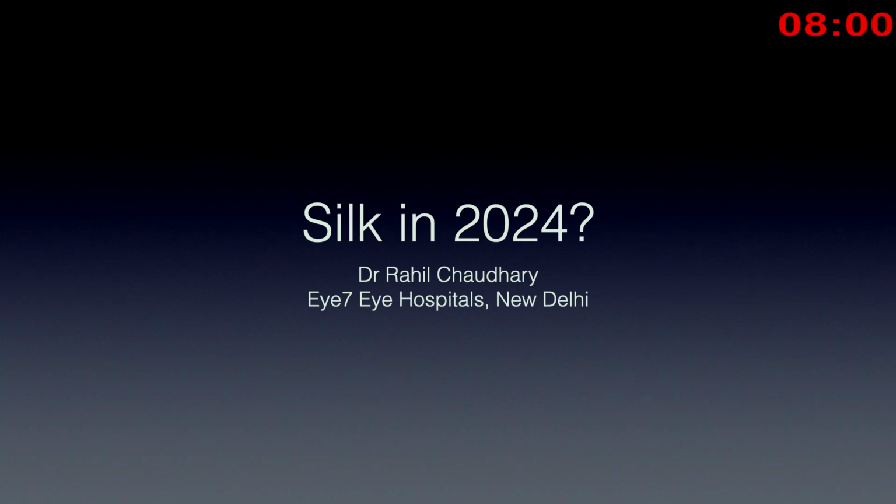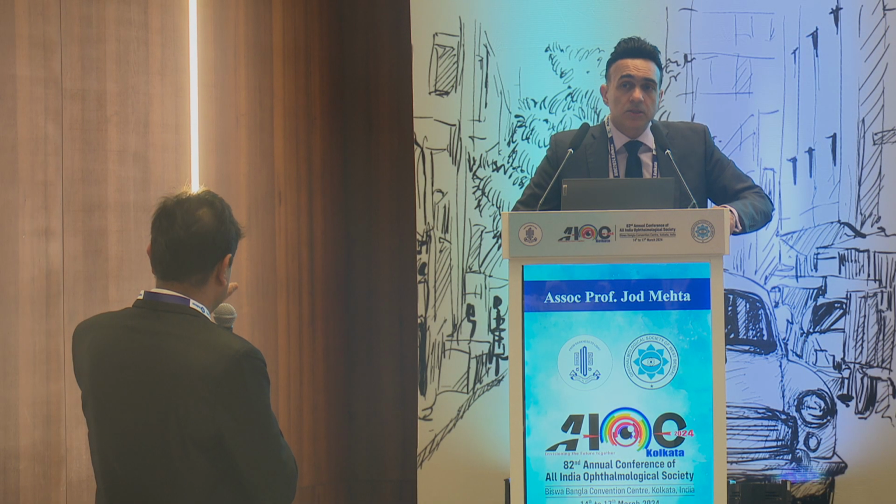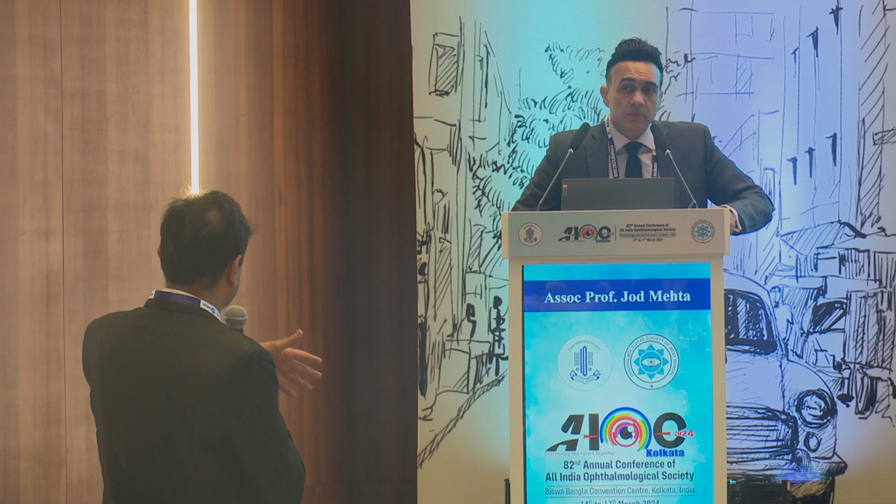In fact, I have a series of 3 patients that we did 7 years back. You're right. One patient had a severe haze, so we had to lift and remove the inlay. The second patient had a cataract, so we just did away with the cataract, but there was cellular infiltration all around the inlay. But she's doing well. She's one of my OR sisters.